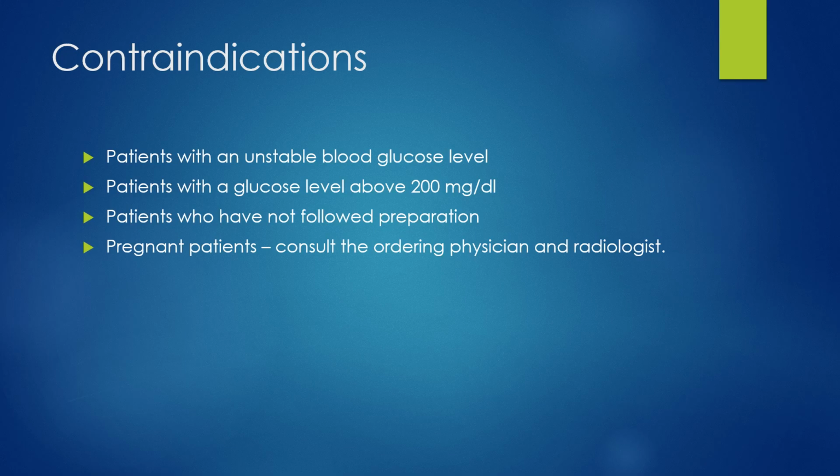And then patients who have not followed preparation, that will interfere with the normal uptake and can lead to false positives or false negatives. And then pregnant patients should consult the ordering physician or radiologist.